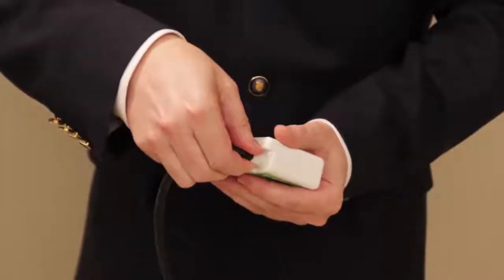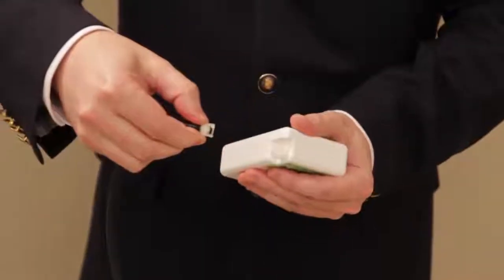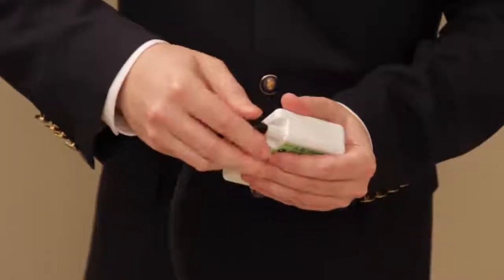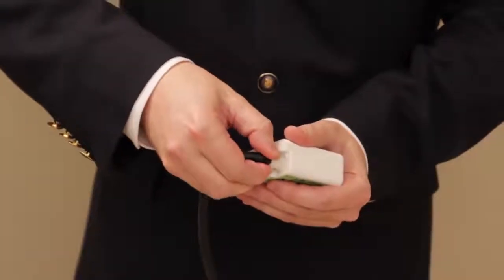To disconnect the cuff, you turn it counterclockwise until a small click is audible, and then you pull. So to connect it, push, turn clockwise until click. To disconnect, turn counterclockwise, then pull.